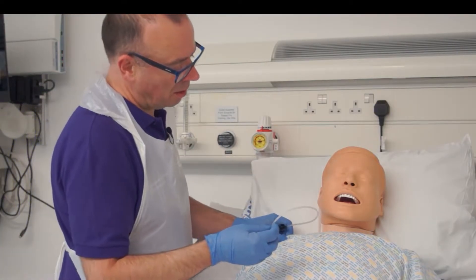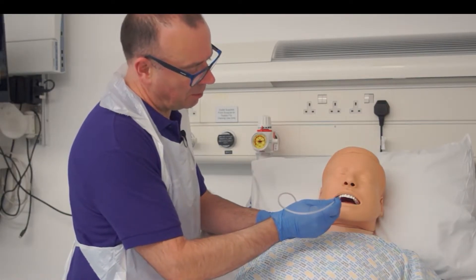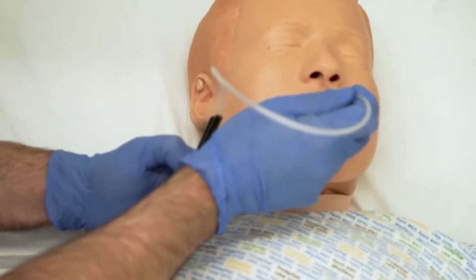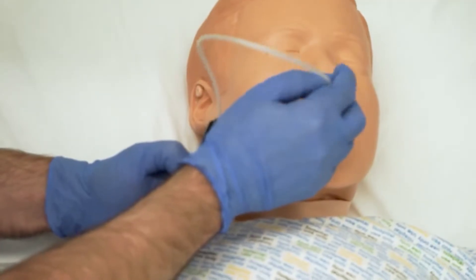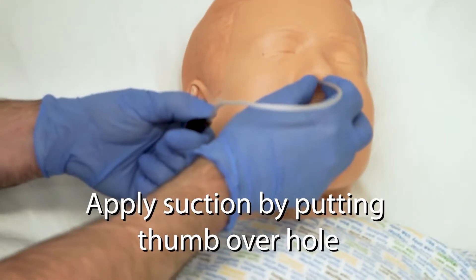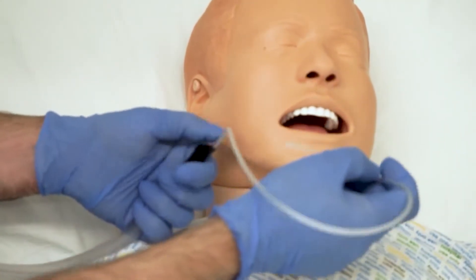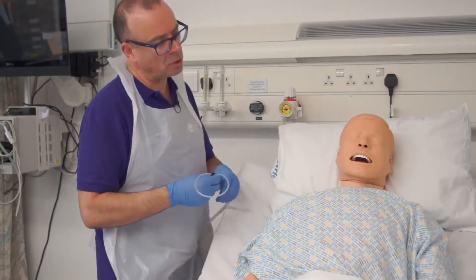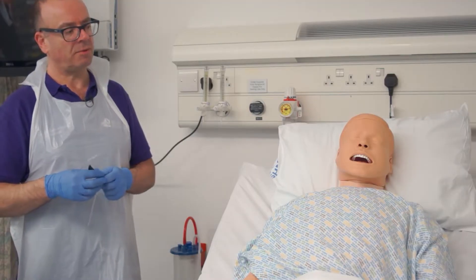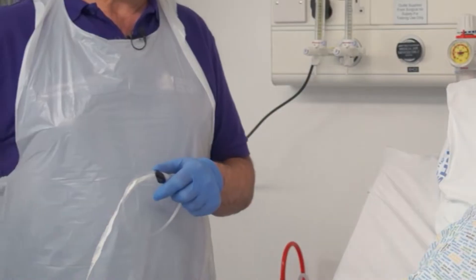So in this instance, Bob, I'm going to pass this suction catheter into your nose. It might be a little bit uncomfortable — if it becomes very distressing I will stop. I'm just gently going to advance that into your nose, about a third of the length of the catheter, or until I stimulate a cough, and then apply suction on the way back, noting what is coming up, trying to do that within about 10 seconds to prevent any discomfort or further hypoxia.